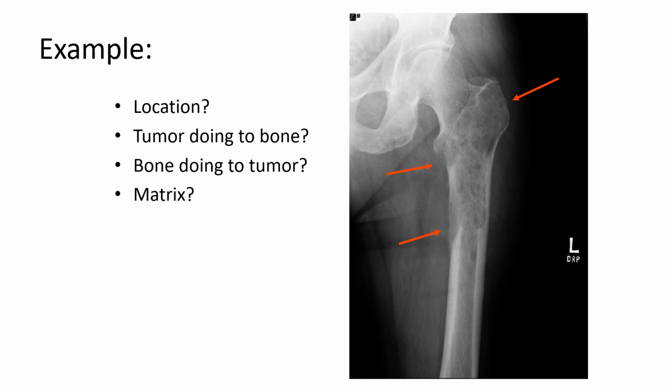This is a skeletally mature patient, and in a skeletally mature patient with a lytic bone lesion, especially a patient over 50, the first consideration should be for metastatic disease.